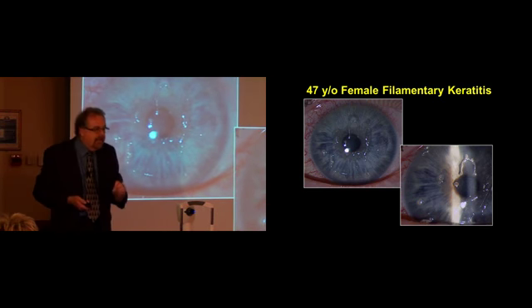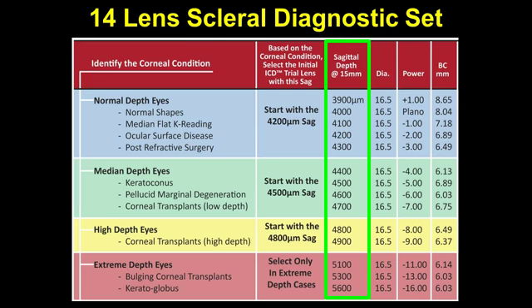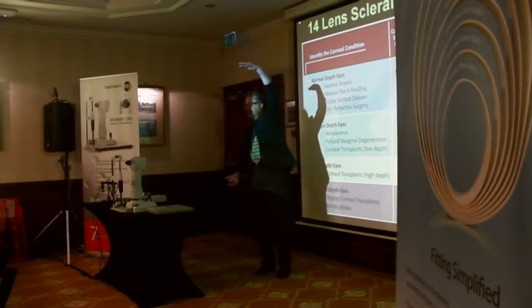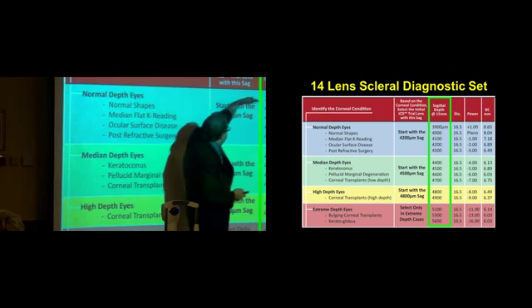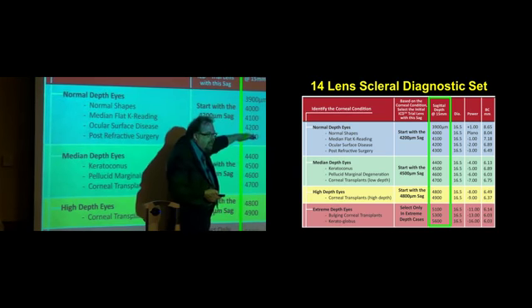It's a non-ectatic cornea, it's a non-surgical cornea, so I'm anticipating that the sagittal height of that cornea is going to be within this realm of sagittal heights.